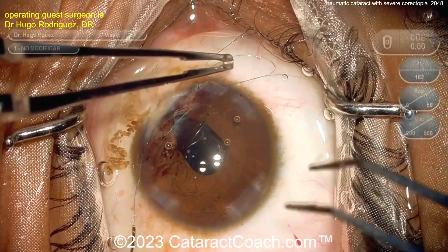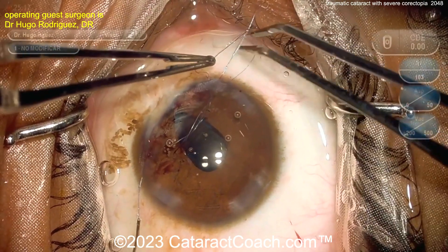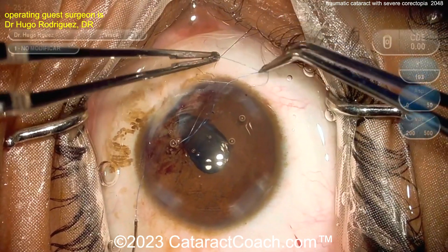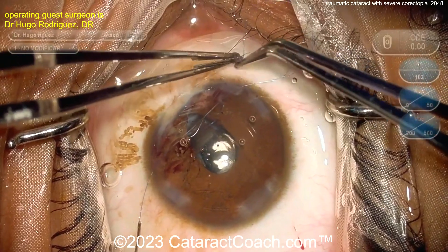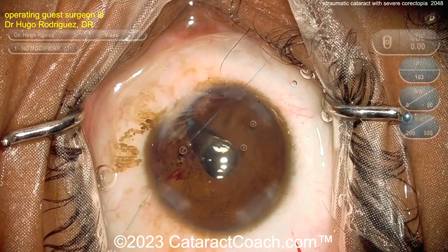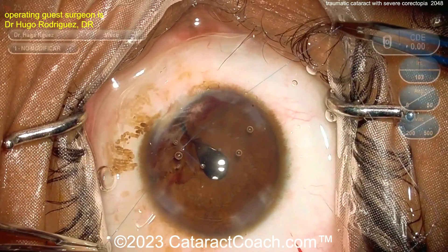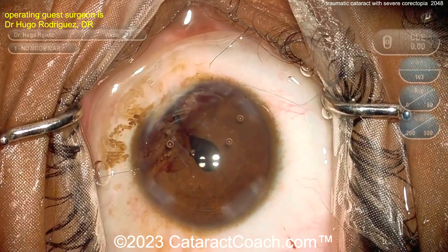You could just do two throws, which is the typical approach, but here we're doing all four: one, two, three, and four. That will suture down very nicely and be very secure. As you pull the two ends — there you go — it cinches down the iris together, and now you have much better centration of the pupil.